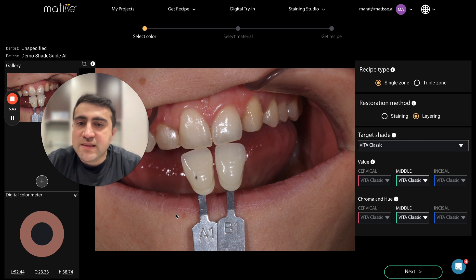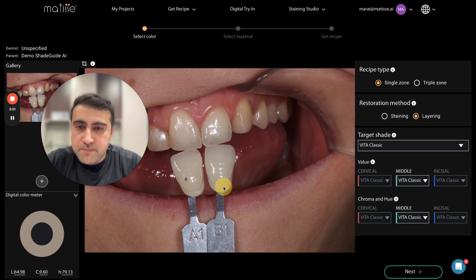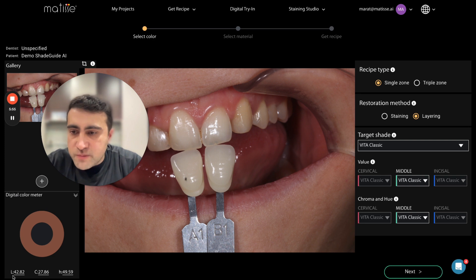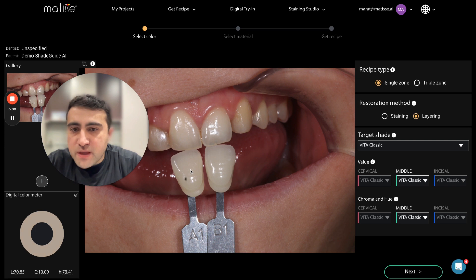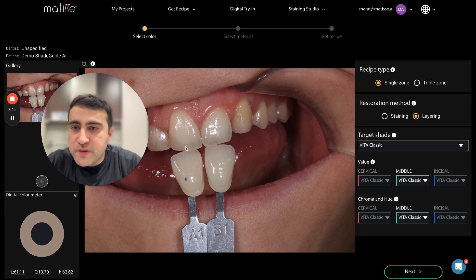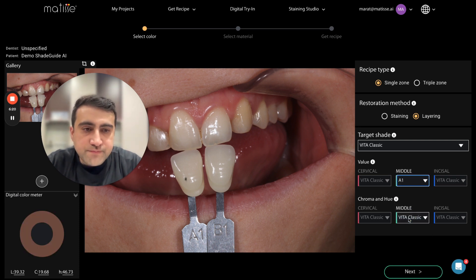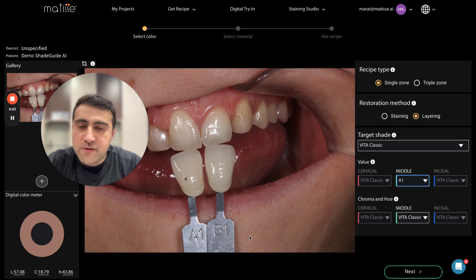You can also use the digital color meter in the left corner to find the closest luminosity or lightness. Luminosity is basically the lightness of the color — we represent it as value, but numerically it's luminosity. In the left corner you see 'L' — the L number of the shade tab should be very close to the L number of the natural tooth. The L of A1 is 71, and the L of the tooth is 71, so A1 is very close in value. We select A1.